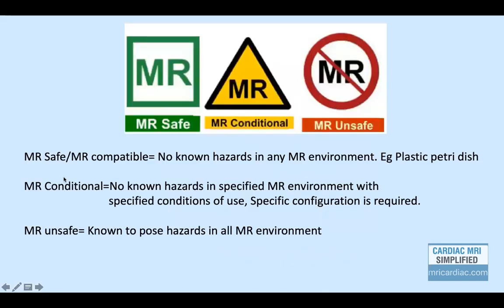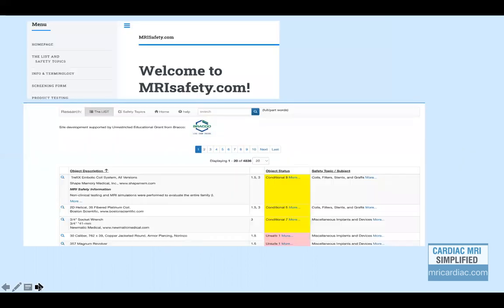So the devices can be classified as MR safe, MR conditional, or MR unsafe. MR safe will include some plastic material which does not cause any hazards in any MR environment. MR conditional basically has some specified conditions of use, and some specific configuration is required. This will include new generation pacemakers or AICD devices. MR unsafe, like a few of the cochlear implants, are never to be taken into any MR environment.